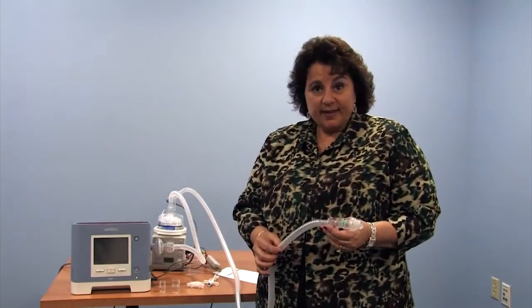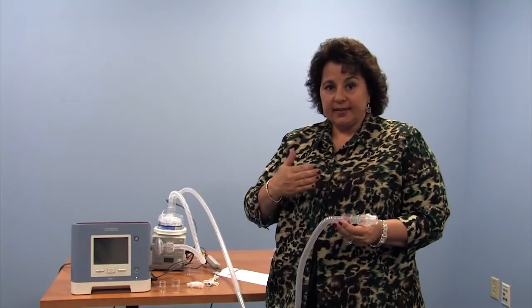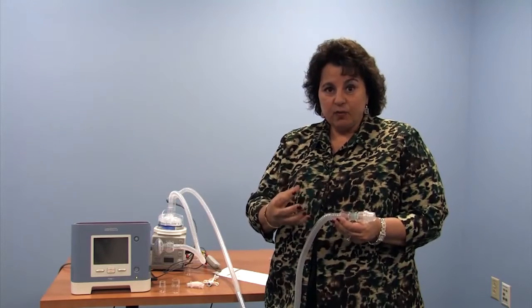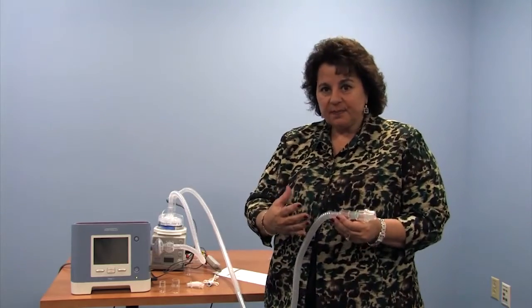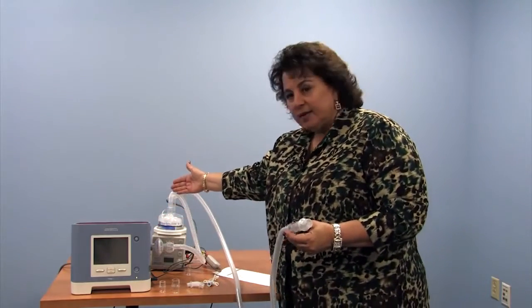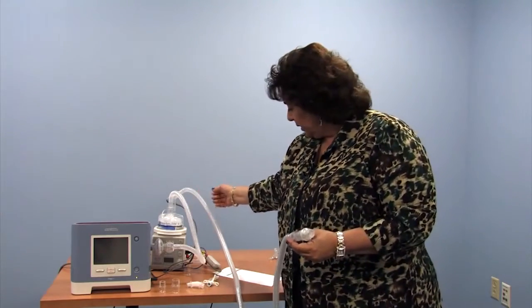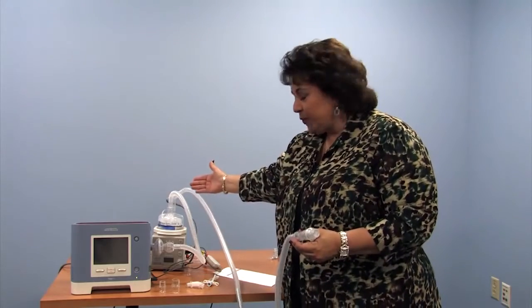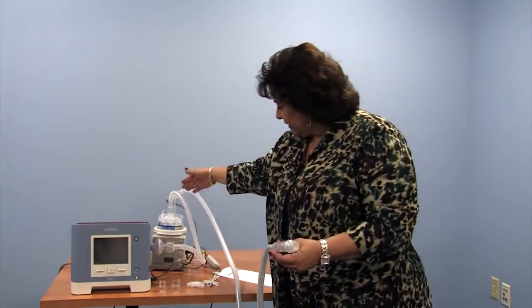I'd like to show you now the passive function of the Trilogy 100 ventilator. We looked at the active circuit, which had an exhalation valve within the circuitry in which the patient inhales and then exhales out through the tubing through the exhalation valve, which generates the positive end expiratory pressure, or PEEP, and controls the breath cycles. What you see right now is the same filter coming out of the machine, sending the air through the humidifier, out the other side, so it's picking up heat and humidity. There's a wire within the circuit that's attempting to keep the air warm and moist as it travels to the end. So we have a single hose.